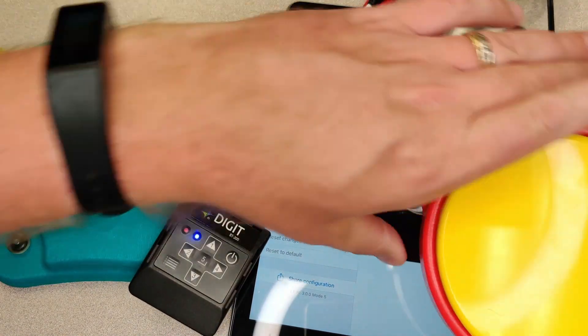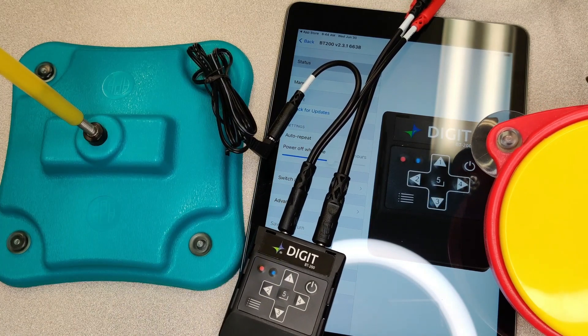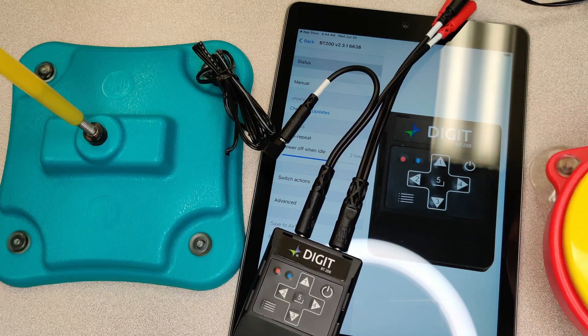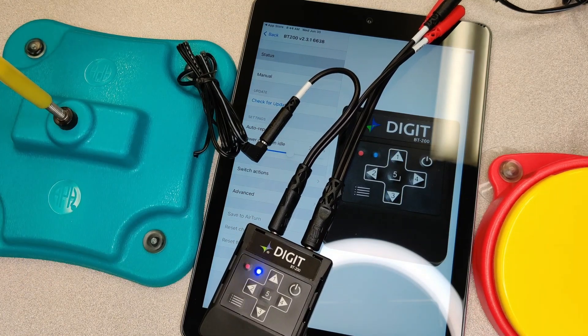I'm going to grab this other big button and hit it — this is showing the three and it's giving an audible beep, letting you know it's working. You could have kids just try this; really they just want to hear some noise output.